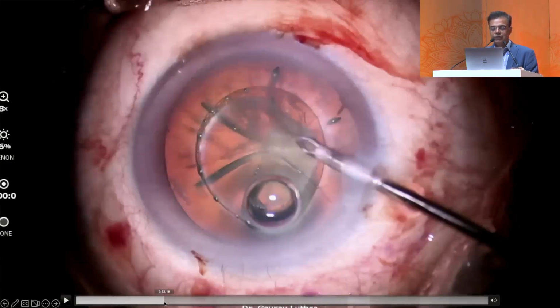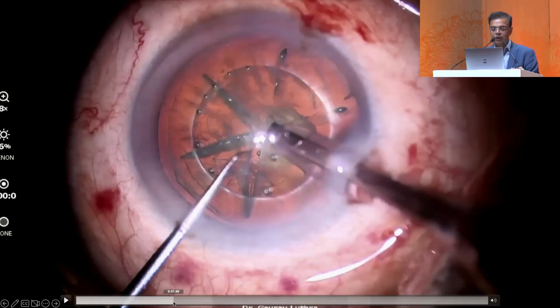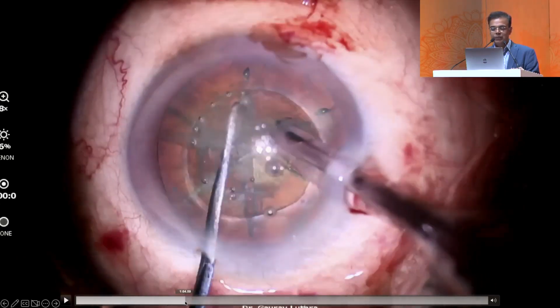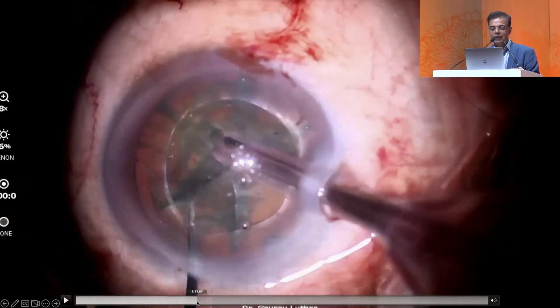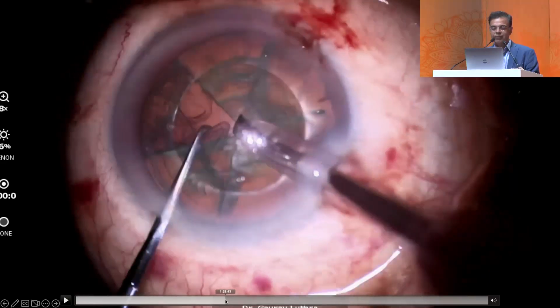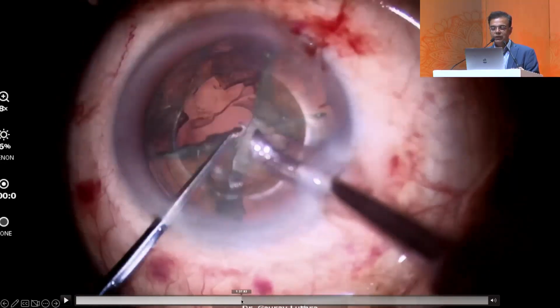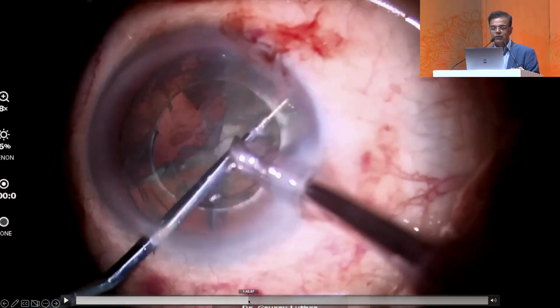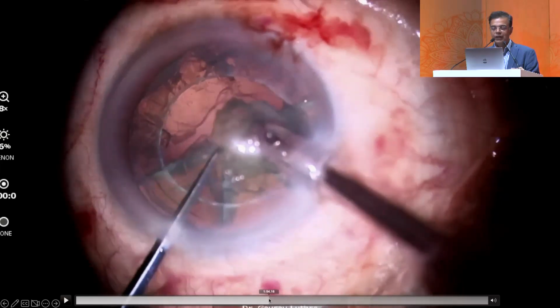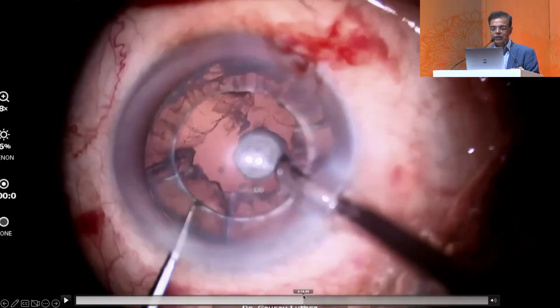Now once you have achieved this, you have a perfect rhexis as well of the perfect size and situation, so that if you have to do an optic capture of the intraocular lens at the end of surgery, God forbid you get a posterior capsular break, you will still be able to do it nicely. So I will not rotate my nucleus at all over here, and my 6 quadrants are already formed. And then I can just gently ease them out without doing any rotation, as you can see over there. I ease out a third one because your template is already formed. The 6 pieces are already formed, so you don't have to go into the situation cracking them. And it also leaves a nice cushion of epinuclear shell, which is going to remain right till the end.